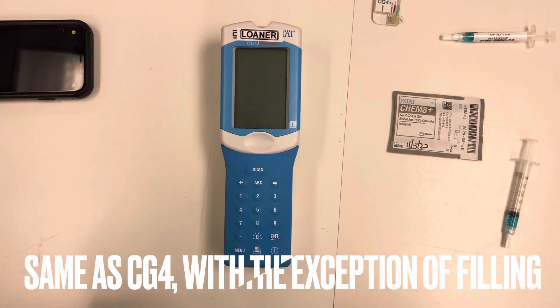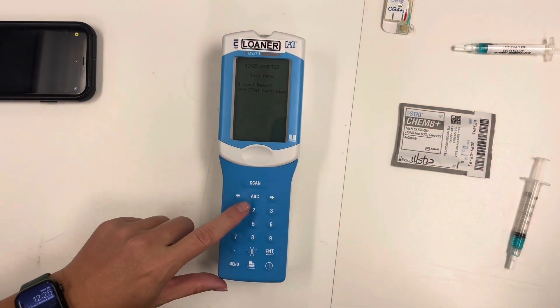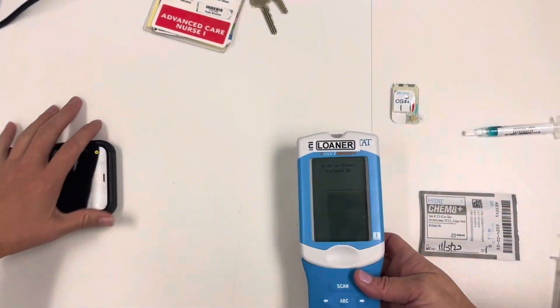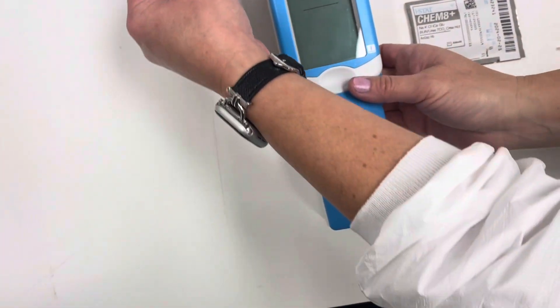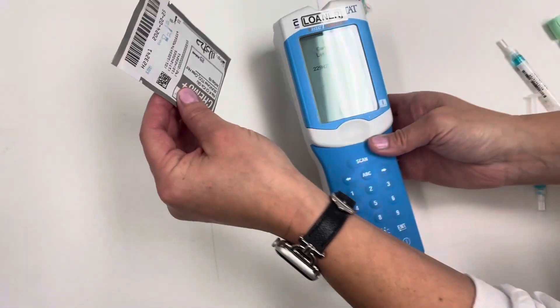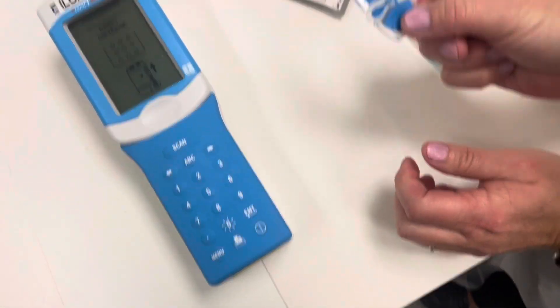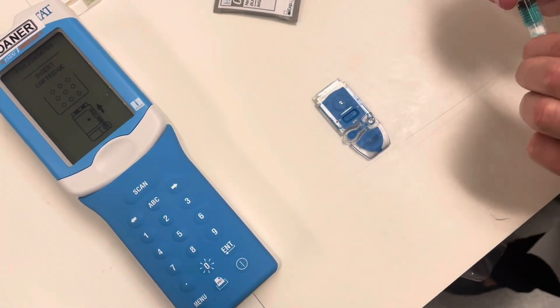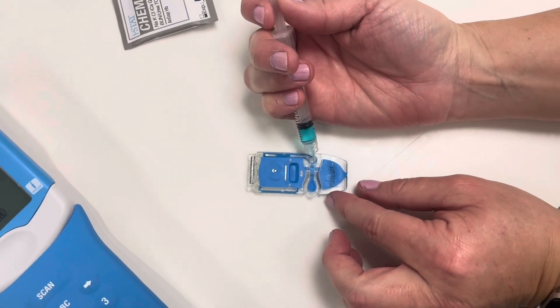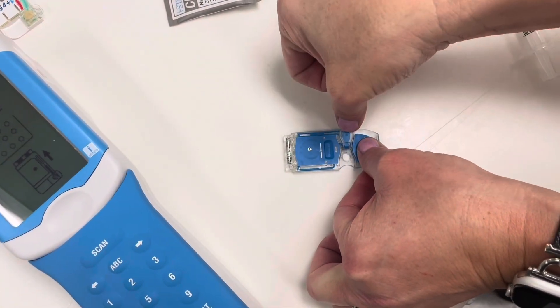Here we're going to run a Chem 8. We're going to power it on, hit number two for iStat cartridge, scan our ID, scan our patient, and scan our cartridge. When it says insert cartridge, we are going to make sure we fill up our cartridge with our patient's blood prior. Clamp it over.